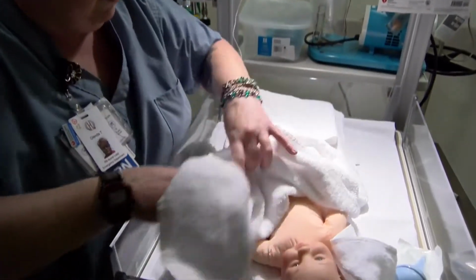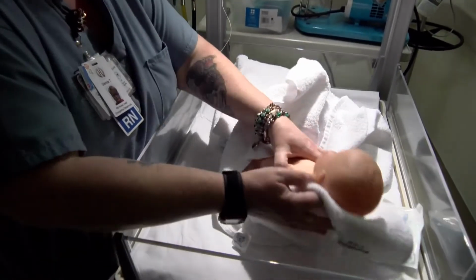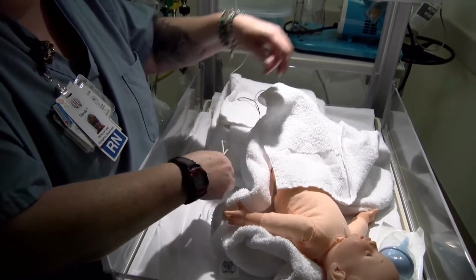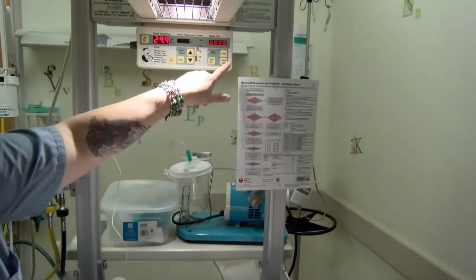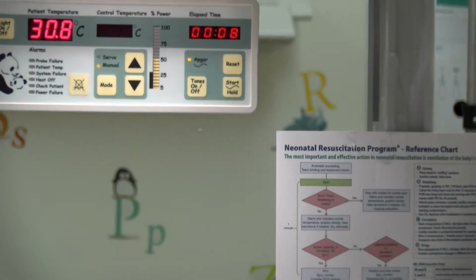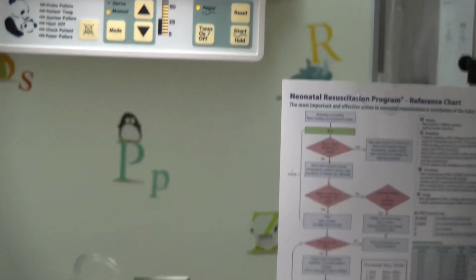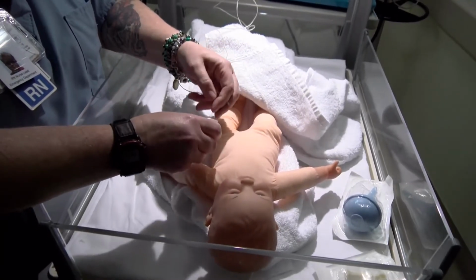You're going to start drying and stimulating your baby, making sure the baby starts crying. You want good crying. Once the baby is born, you're going to turn on your Apgar timer, and you're going to hit start. Your Apgar timer is right here. You're going to do a series of certain things to check. You're going to check for infant tone, see if they're crying, if they're making any noise, are they grimacing, what is their heart rate and their respiration.